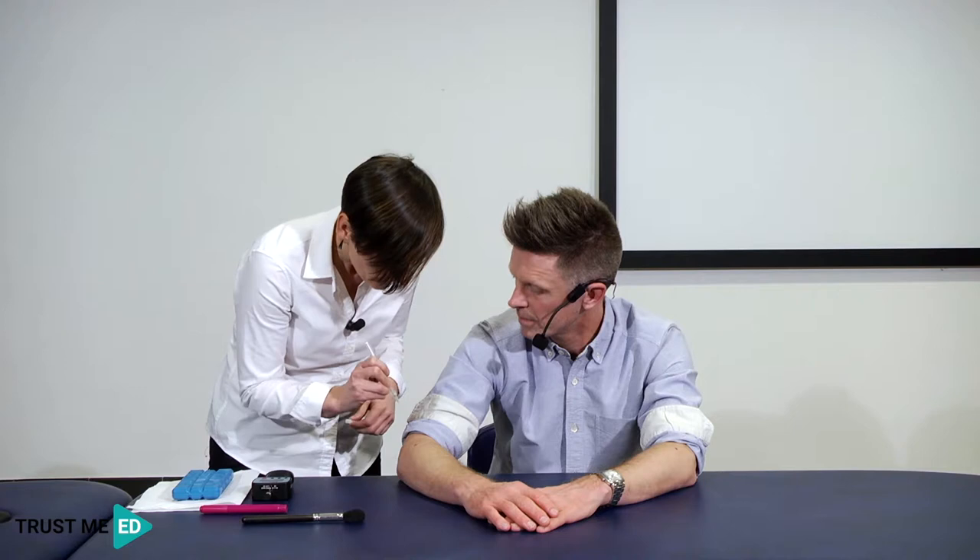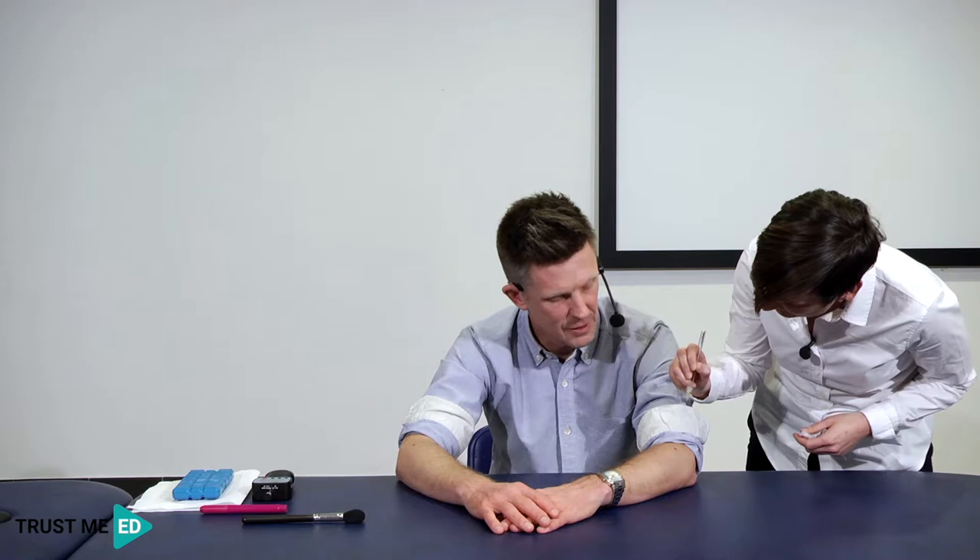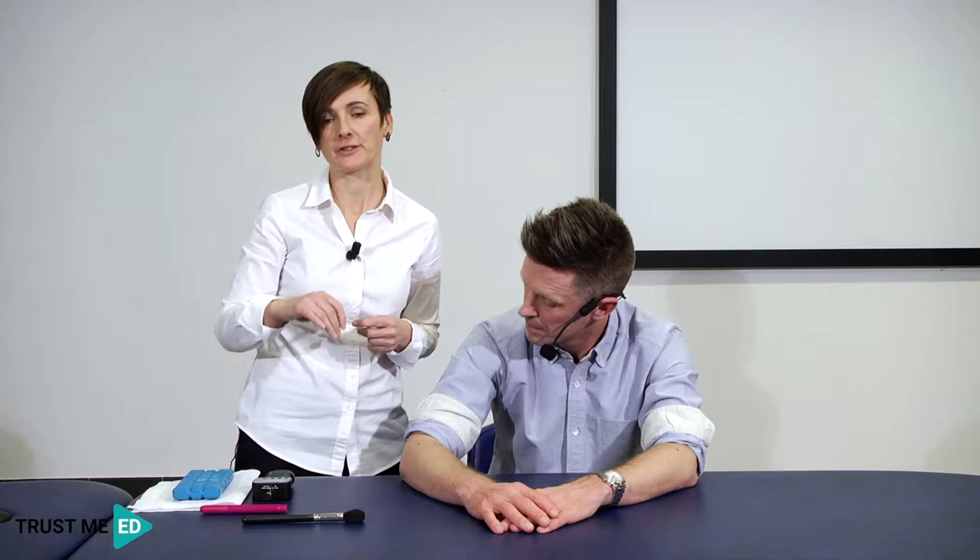The next test is for mechanical hyperalgesia. Martin, I'm going to prod you with this filament — just gentle pressure. Tell me if you feel any pain. He rated it about two or three out of ten, settling on three. Comparing to the unaffected side, he felt just pressure — no pain. So there's a difference between the two sides. As I apply this I press only until the filament starts to bend, which standardizes the pressure. That's one reason why von Frey filaments are better than just doing pin prick.